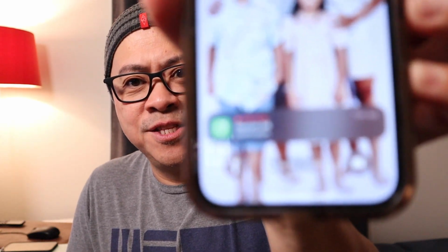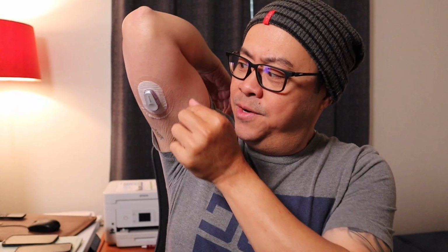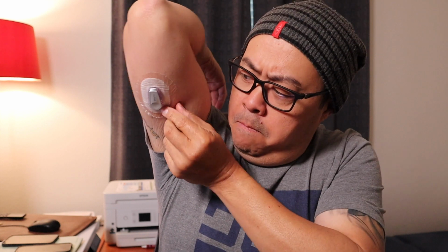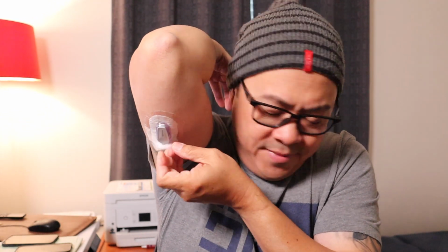I couldn't find my phone, but I finally found it, and it actually has the message that the sensor is expiring. The message is down there. Sorry, you can't see that. There you go, it's down here. So that's, I guess, the last time we'll be seeing a DEXCOM G6 notification, since we're switching over. So let's do this. I'm going to go ahead and rip the DEXCOM G6 off, just like every other time. There is our sensor.